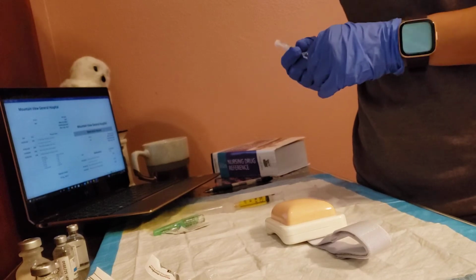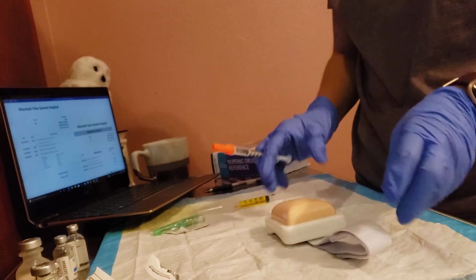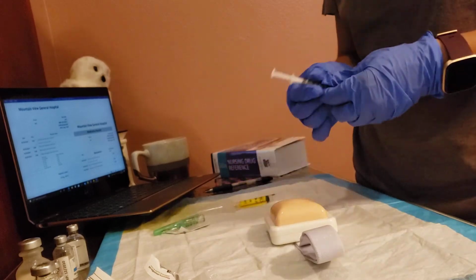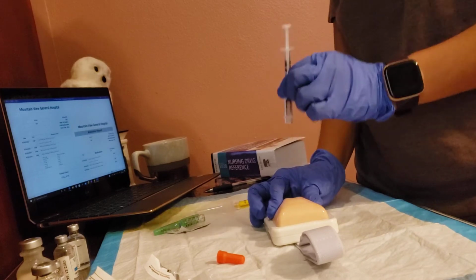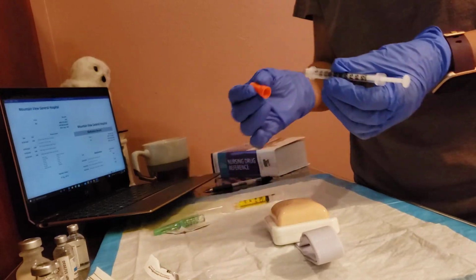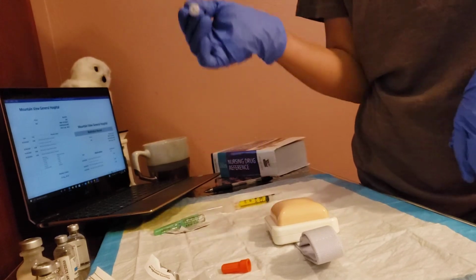So I'll ask Mr. Buzzard, Mr. Buzzard, I'm gonna go on your left, okay? Because the last time we gave it to you on the right. So I'm gonna do the left now. So I'm gonna want to go a few inches away from his umbilicus, and I am able to pinch his skin. So I would be pinching, and I would do a dart like motion and just give straight in and out. If he was thin, then I would go at about a 45 degree angle, and I would give it to him at a 45 degree angle.